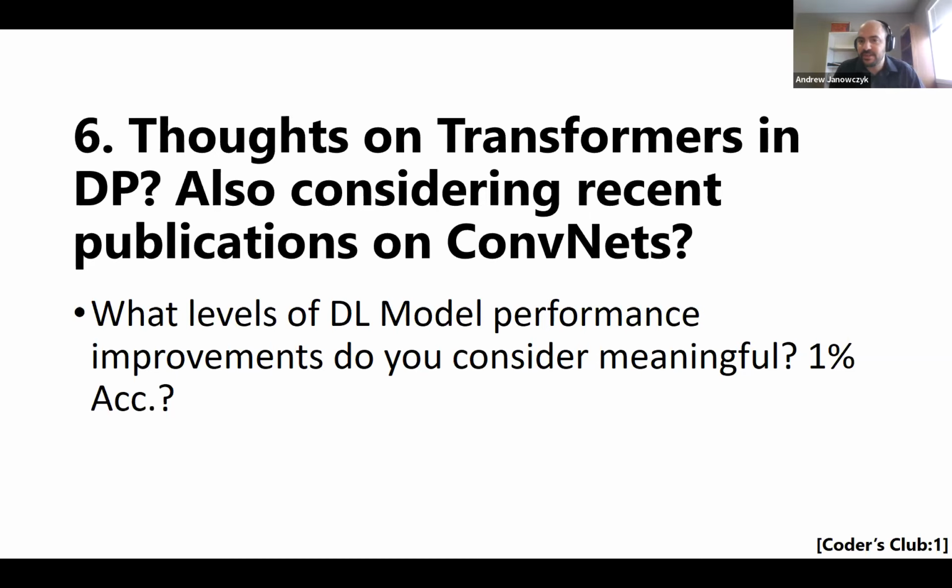The other thing that troubles me is that I know for a fact that if you randomly train a deep learning network 10 times, you're going to get 10 different models and 10 different results. The standard deviation of those results is important to understand as well. So anytime I see a paper that says, we did a single training and we have a 5% improvement, that could be minus 5% if you randomly trained it again from random weights to begin with.